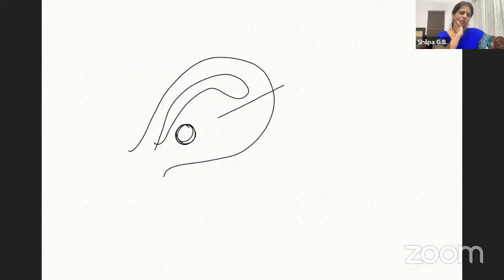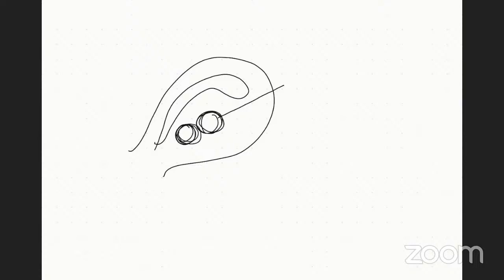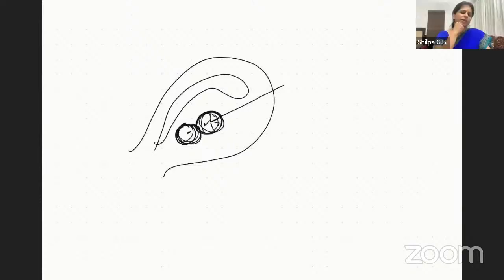Can you see? So these two guys, no? The farther you are away from the tip of the probe, the lesser is the ablative effect. Understanding? So you have to be ablating in such a manner that this concentric radius doesn't overlap by more than 2, 3, 4 millimeters. By doing that, you will save that myometrium which you spoke about.